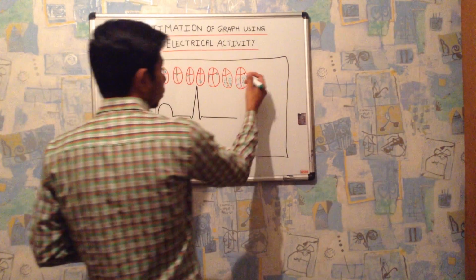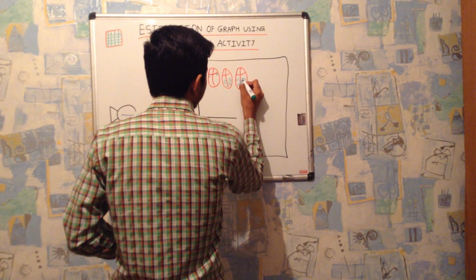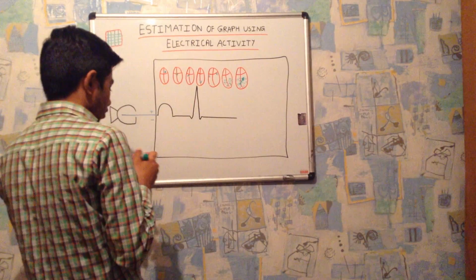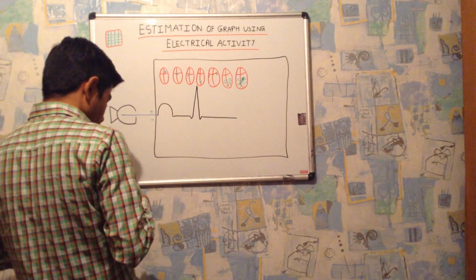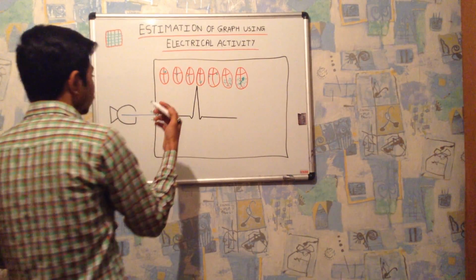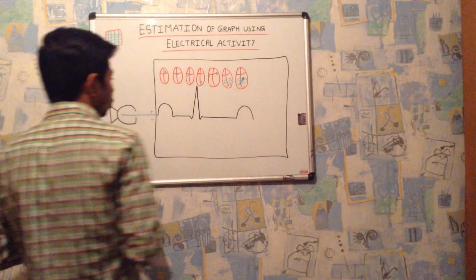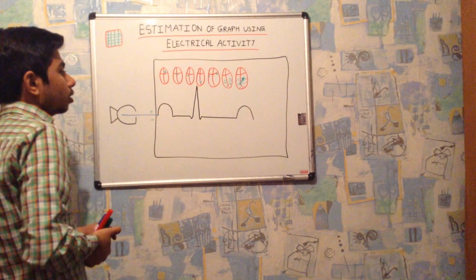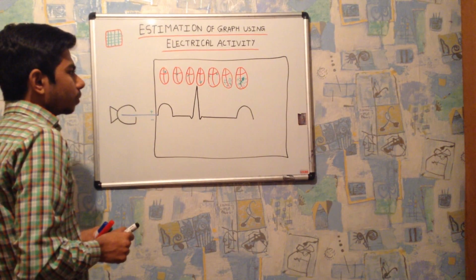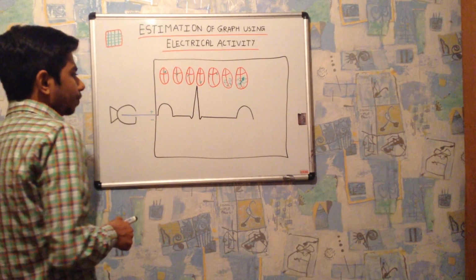This is the depolarization, where repolarization is starting. So repolarization is going like this, in this direction. Due to this event, the repolarization of our ventricles, there will be fluctuation in the needle of the galvanometer towards the positive side, and again it will retain its initial position. However, in some rare cases, there will be a fluctuation we call the U wave, and that will be seen when electrical impulses are moving inside the papillary muscles or Purkinje fibers of our heart.